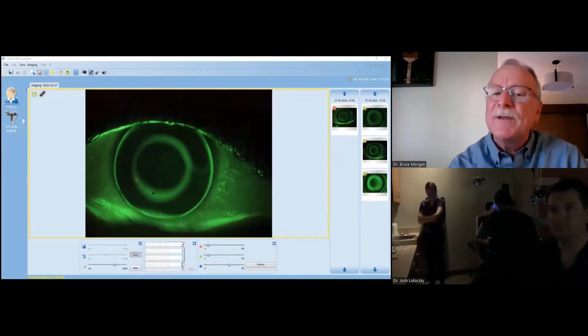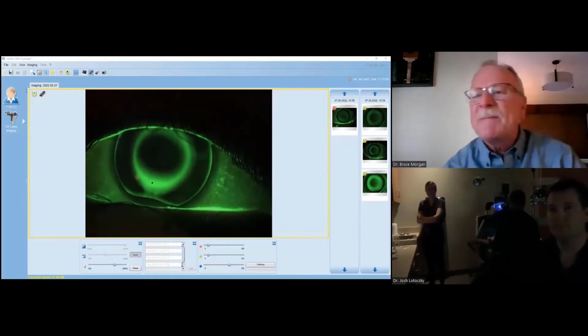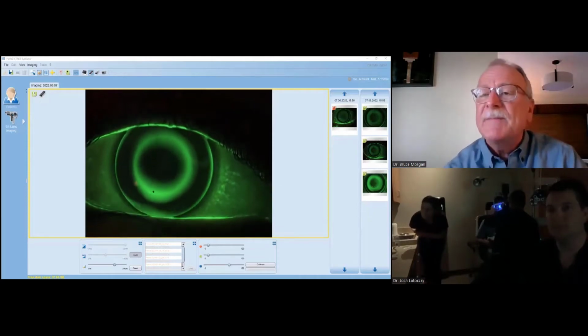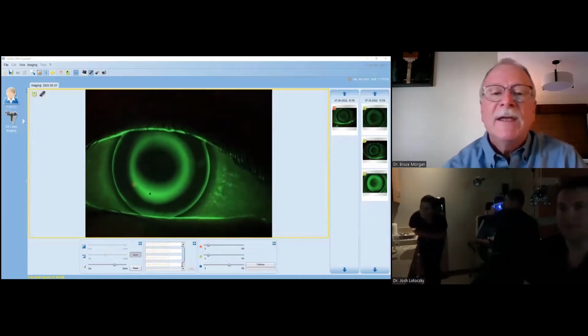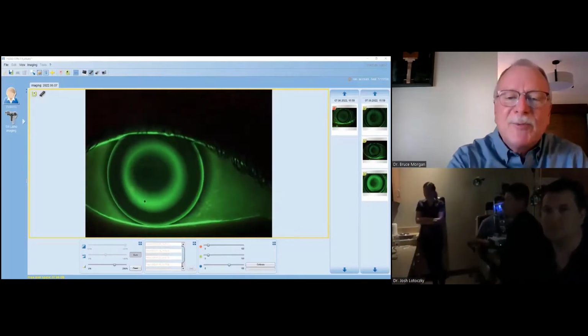If it looks like a pretty good bullseye like this does, whereas if it's pretty much lateral or whatever, then there's still a good chance that when they sleep, that thing's going to align and do well because of that nice, distinct mid-peripheral band.